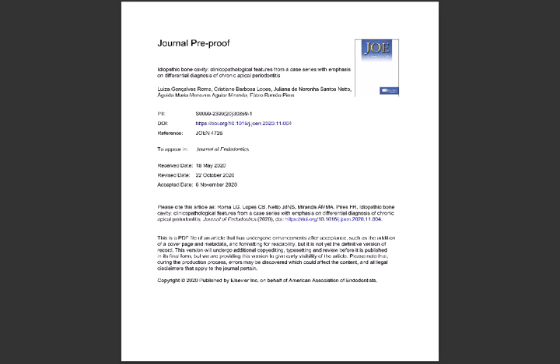Information about pulp vitality and panoramic radiographs was available for all cases. All images were accidentally discovered in panoramic radiographs. Patients did not have any signs or symptoms. All cases were submitted to surgical exploration performed by oral and maxillofacial surgeons for diagnosis.